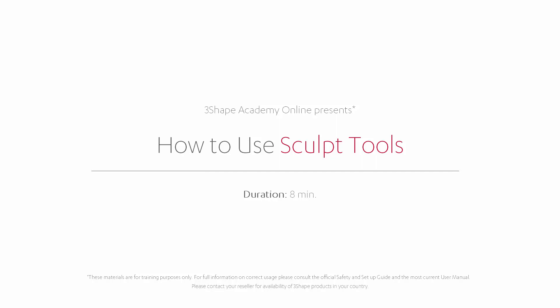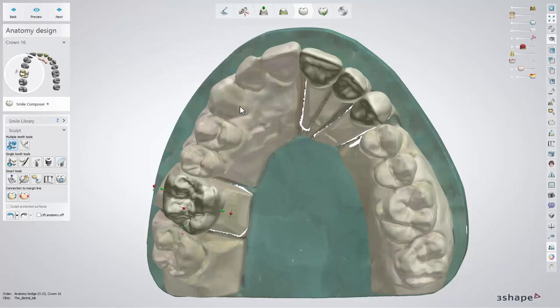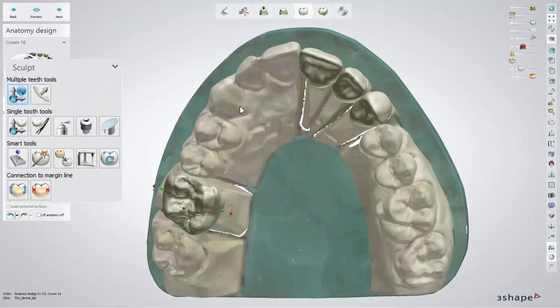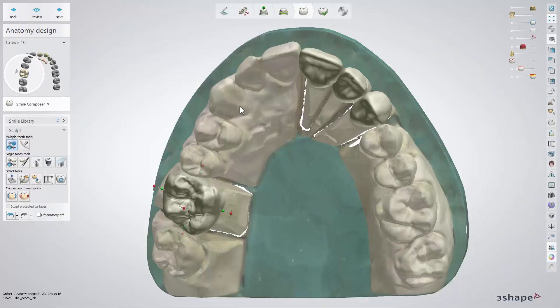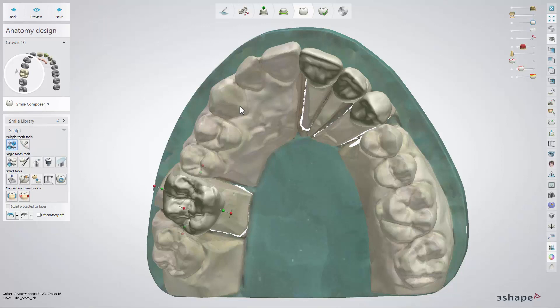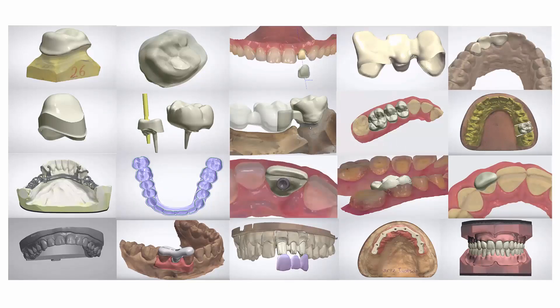In this video we will show you how to use the Sculpt Toolkit in Dental System. The Sculpt Toolkit is a set of powerful tools which appears in the anatomy design step to enable you to transform and shape your restoration. The toolkit is similar for all kinds of restorations and consists of the following tools.